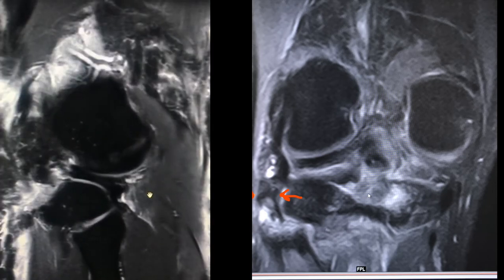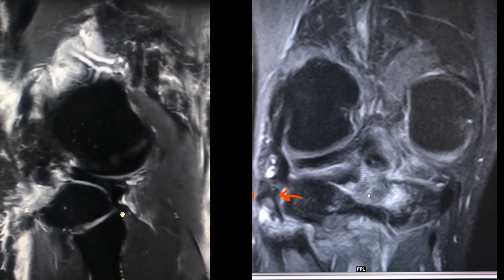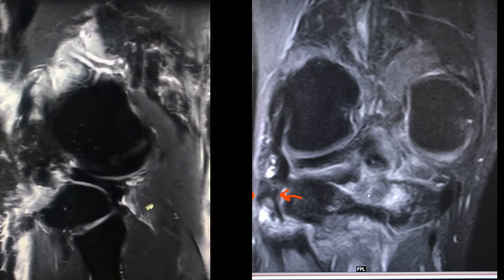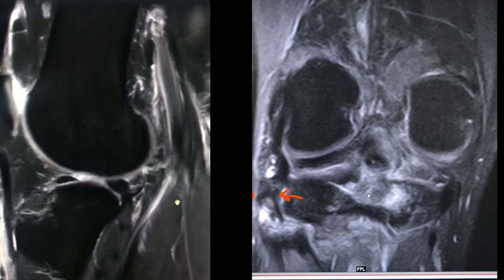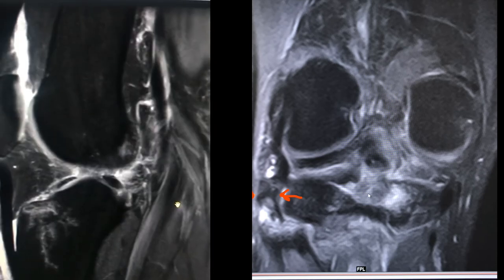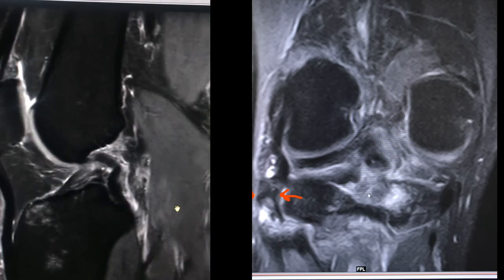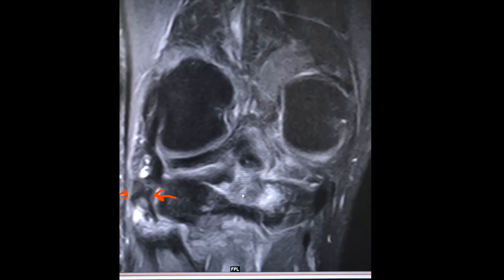There is a grade one injury to the popliteofibular ligament and the arcuate ligament, with posterolateral capsular injury. There is also an associated complete tear of the ACL.